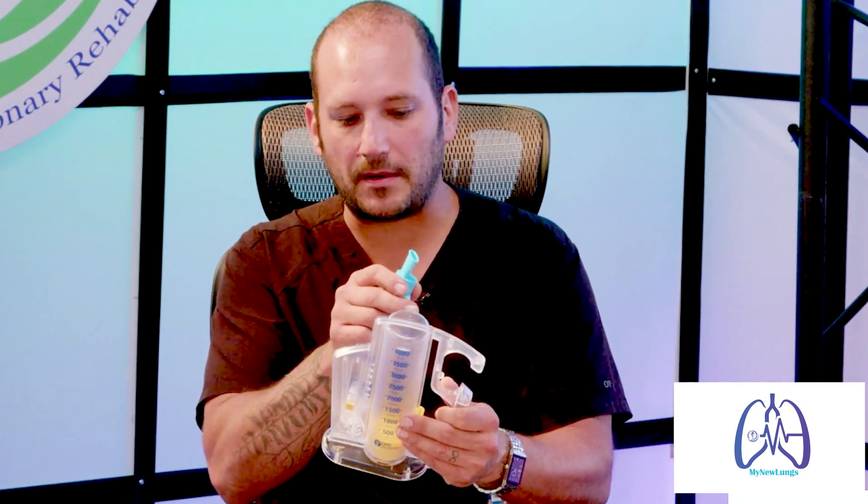So when somebody measures on their incentive spirometer — and I'll show you how to do this really quick. Make sure the Delta V is set to zero. I need to measure, so I need to get rid of all the air from my lungs first. Because if there's air inside my lungs and I'm drawing air in on top of that, how do I know what I started with? How do I know I have 500, 750, 1,000, or 1,500 in my lungs to begin? You have to get rid of all the air so you can correctly measure how much air can come in.